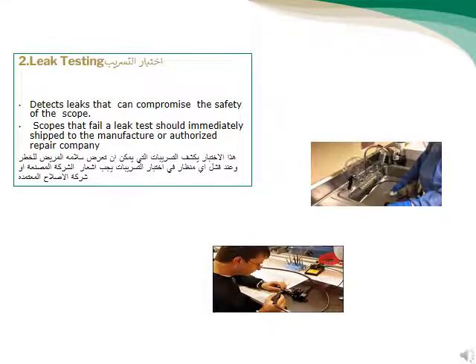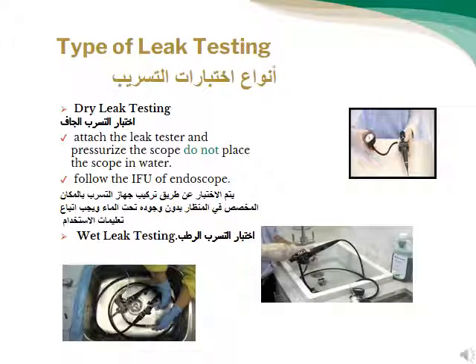Leak test: it confirms the integrity and safety of the scope. Types of leak testing: dry leak testing and wet leak testing. اختبار التسرب هو اختبار للتأكد أن المنظار يعمل بالشكل المطلوب، وفي حال وجود أي مشكلة يتم إصلاحها من قبل المختص.